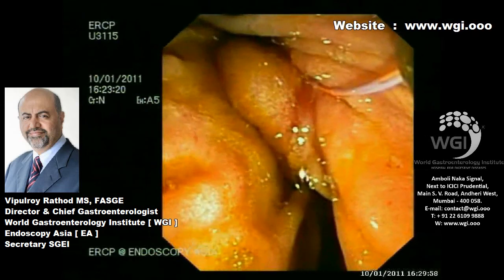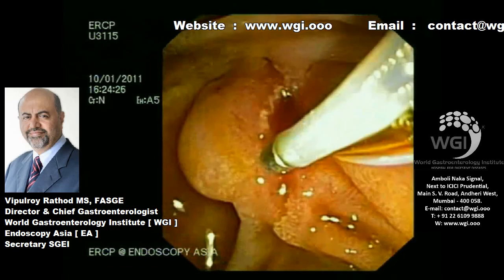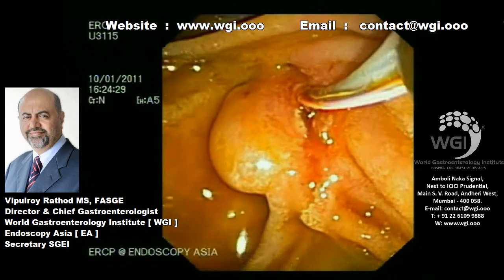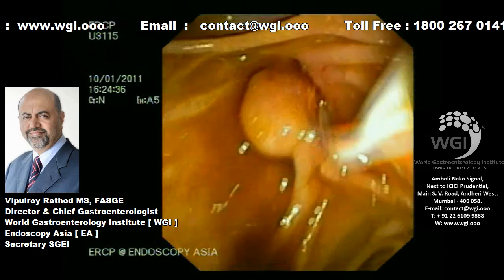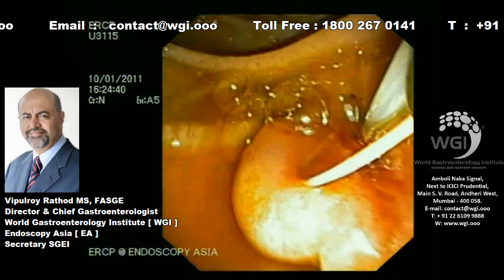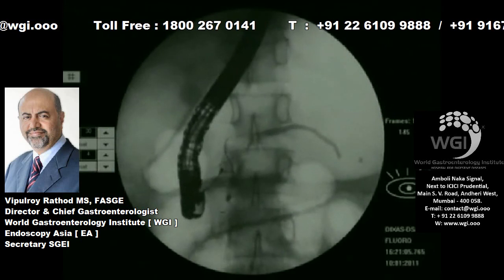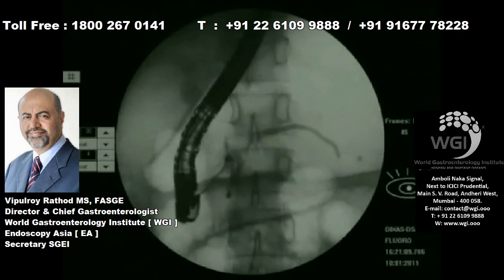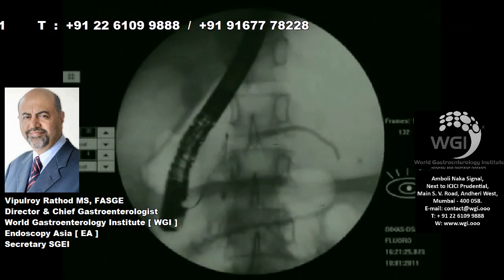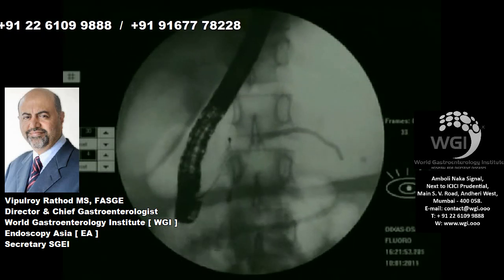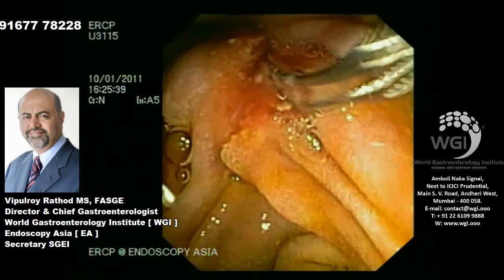We will try to pass a small Dormia basket by the side of the guide wire to take out a few stones. You can see bile flowing from the biliary sphincterotomy easily. I prefer to put the Dormia basket alongside the guide wire — it gives me some guidance on fluoroscopy whether we are in the right duct or going into side branches. Once we are in the main duct, we remove the guide wire. I know we are in the accessory duct, which is loaded with stones. We are jiggling the Dormia on fluoroscopy to clear part of the stone load from the accessory duct.